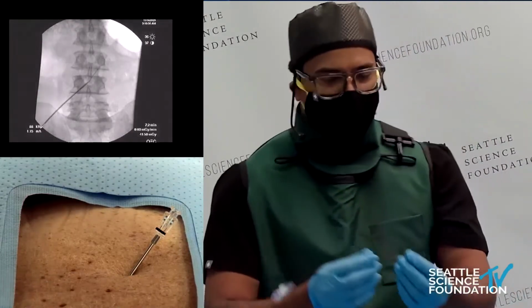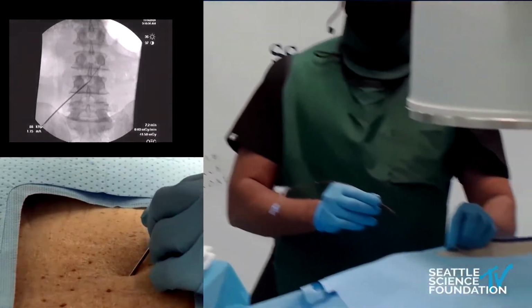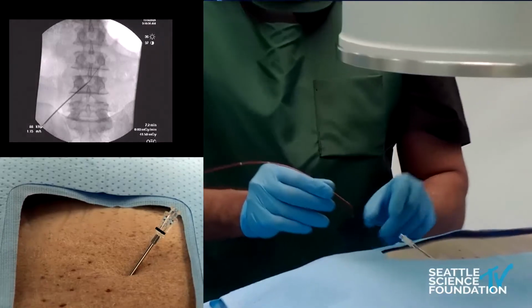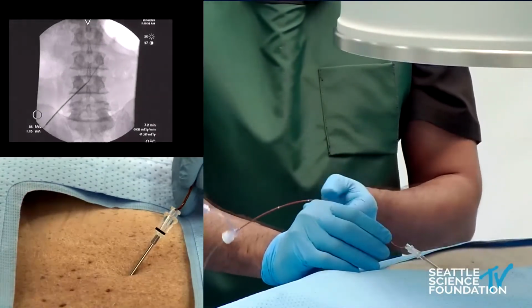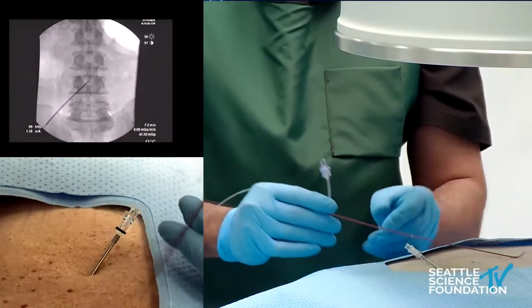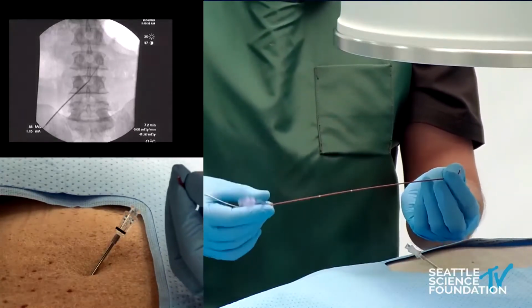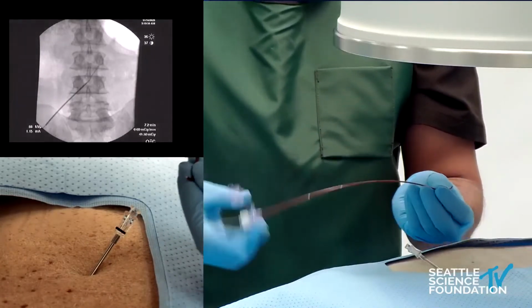All right, so we're going to go ahead and start with insertion of the sheath and lead. You can see the needle here. I have the bevel up. The bevel up is the black line here. And it's really important to understand the orientation of all of these pieces. I always want my flush port and my bevel to be oriented together, because if they are not together, you can create shearing of the sheath. But more than that, you really lose your steerability and power to drive the system.